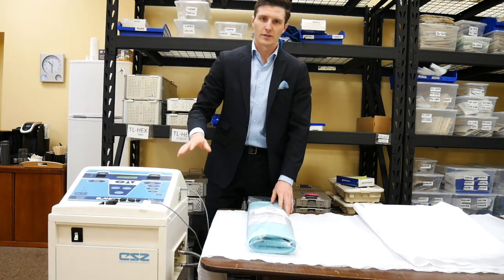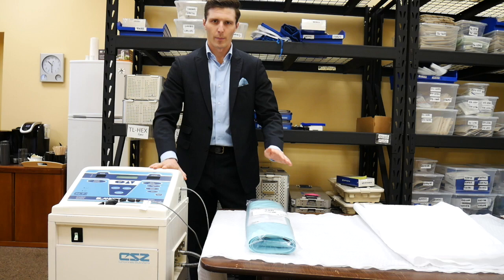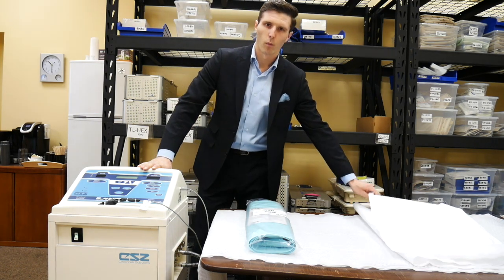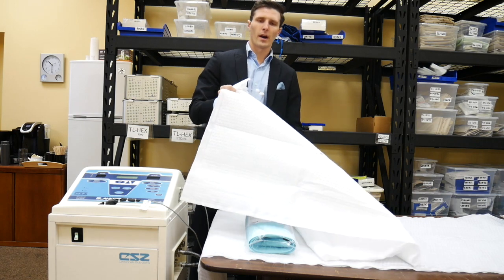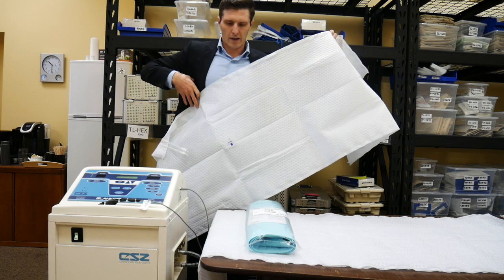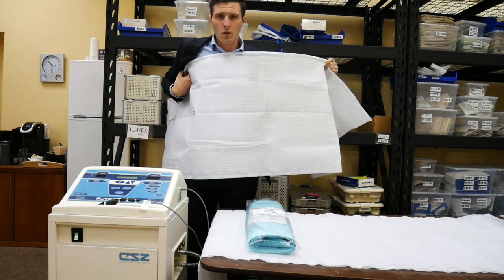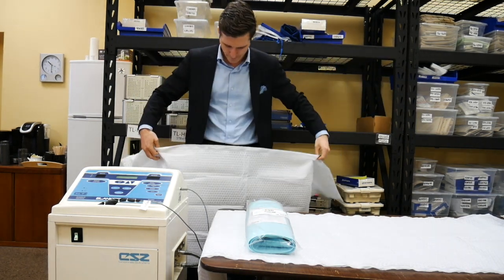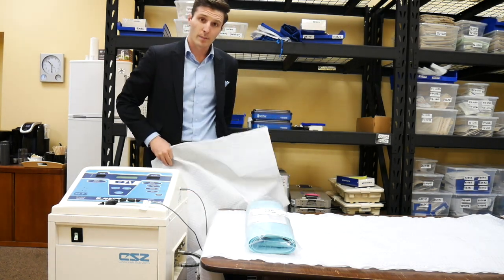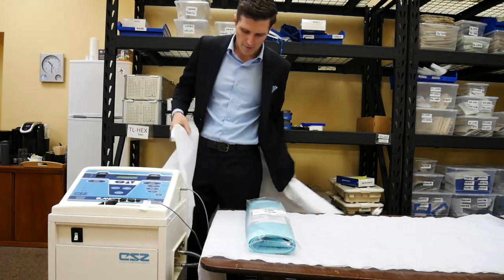For the blankets, you can either sandwich the patient with one underbody and another over top, or if you wish to opt for the burrito method with one underbody or lower body and one upper body, you can wrap the patient over top, going underneath the axilla like so. Or at the lower body, you can go over top, tucking into the groin, or place the blankets on the bed prior to having the patient and tuck like so.